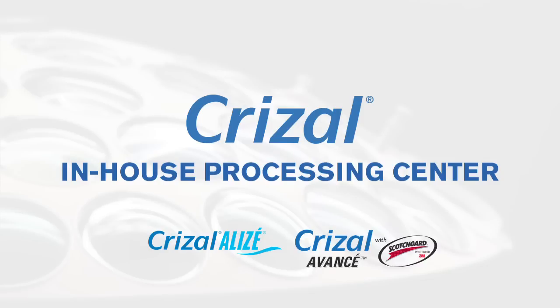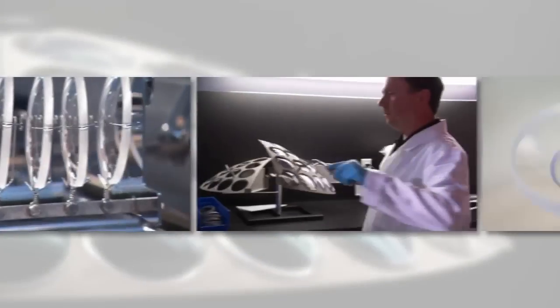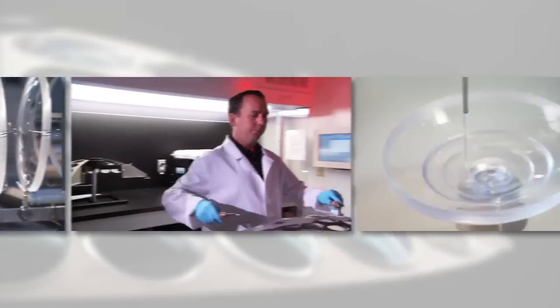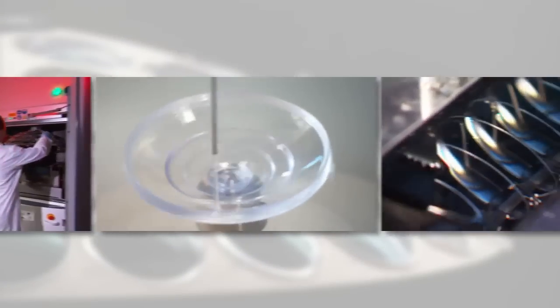To meet our goal of providing the best products and customer service, our lab has installed an in-house Crizal AR Processing Center, providing the highest quality no-glare lens technology in the industry.